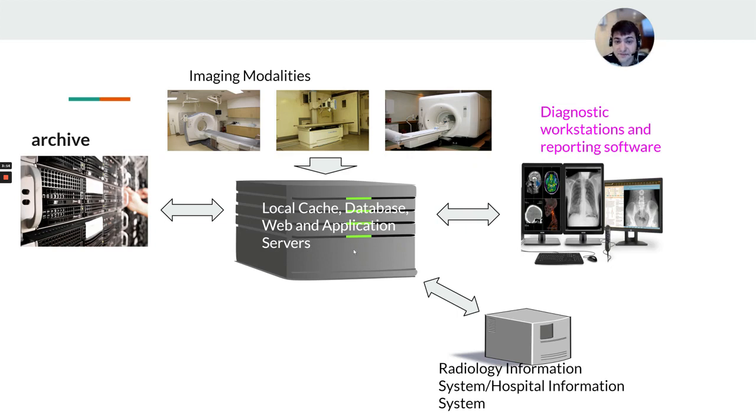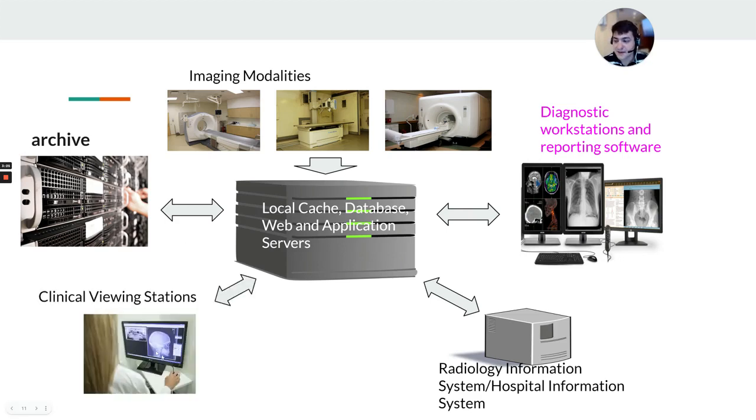Now, the last thing left for us is the final stage, and that's when the clinicians that are actually treating the patient are going to look at the images and read the report. And that's where the clinical viewing stations come into play. So again, it's a double-edged arrow because anything that's saved on PACS can be sent back to the central repository. But in all reality, in most cases, it's just going to be the clinicians looking at images.